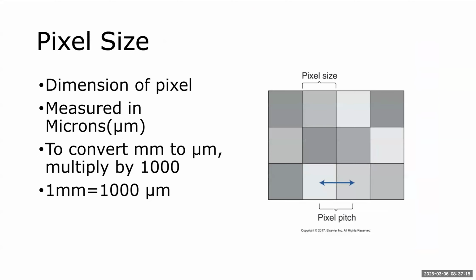There's many different descriptors that we use to talk about pixels. So pixel size is the first one we're going to address.